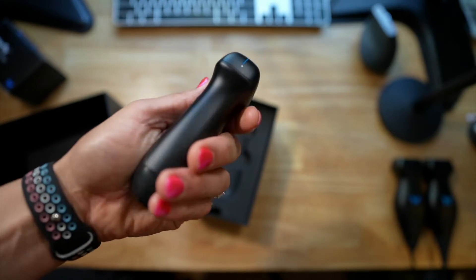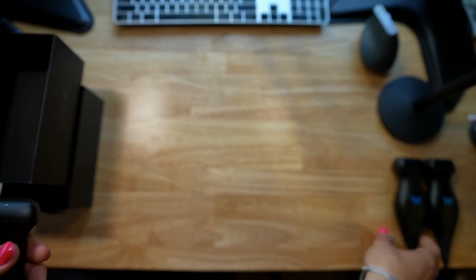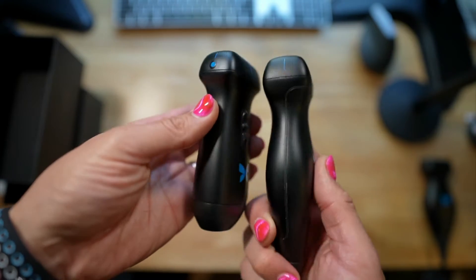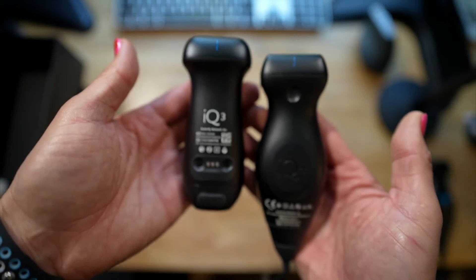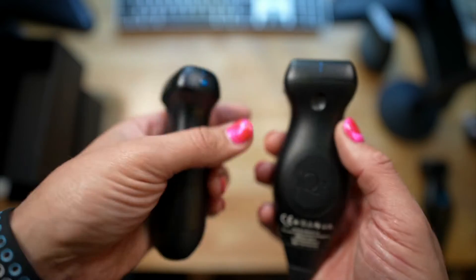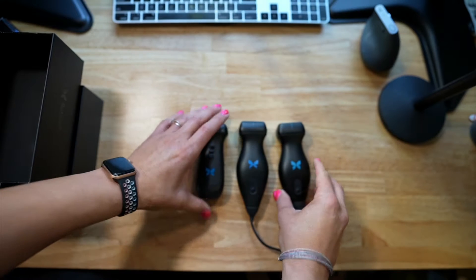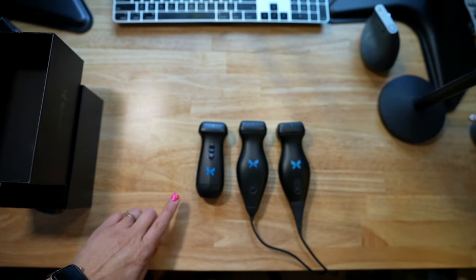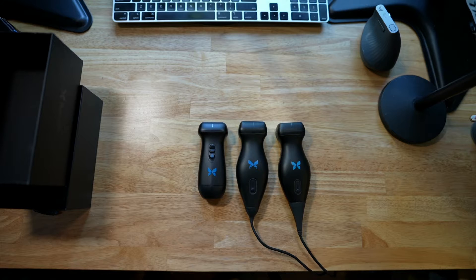It's small, it's slicker. Let's compare it to the IQ Plus — this is the most recent version. You can see quite a big difference in the form factor. And then if we put all three together, we have the original IQ, the IQ Plus, and then the IQ 3, which we're excited about.